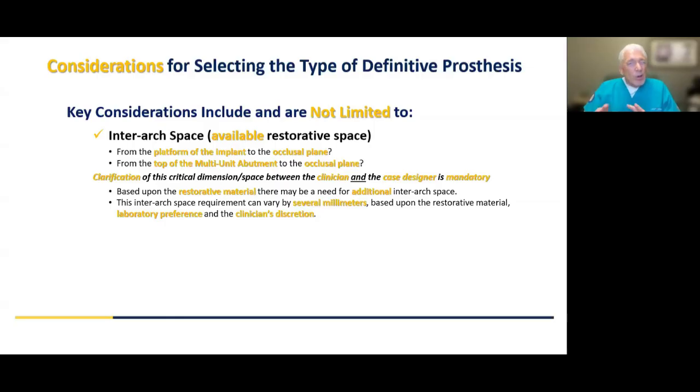So there's almost always some alveolar bone reduction that needs to be done. For patients who are edentulous, maybe there doesn't need to be any, maybe just enough to flatten the bone off or create a more conducive anatomy to the alveolar ridge, so you don't have dips and valleys where food can be trapped and be hard for the patient to maintain.